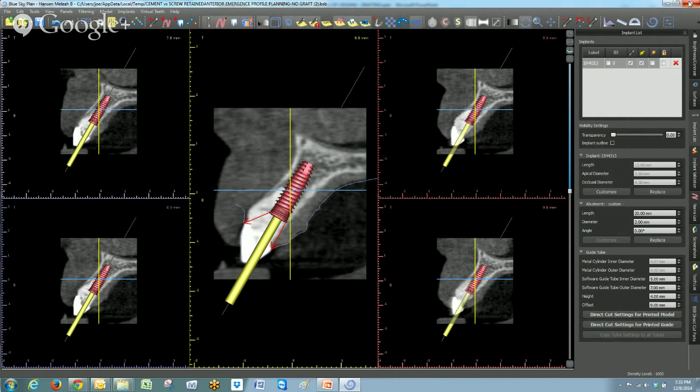We are going to address all of that in the fourth program, and that'll be in January. That particular presentation is going to have a lot of state-of-the-art importing of models, placing. We're going to show how we can place an analog in a model that we make at the lab that's indexed to the timing of the implant from just a CT scan and digitally scanned arches that we import into software, meaning that there's no models involved at all.